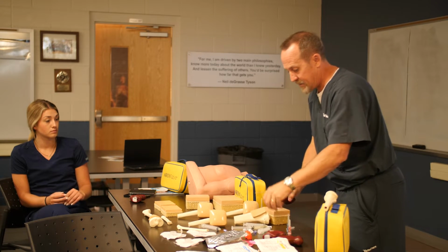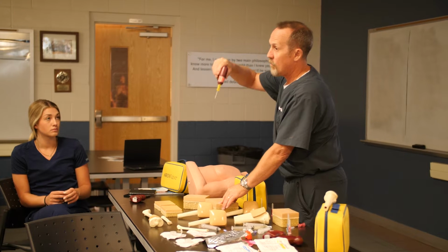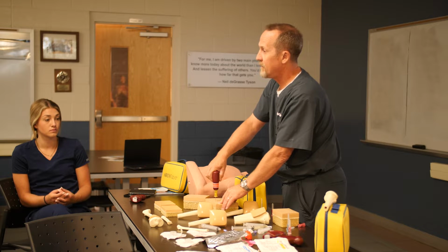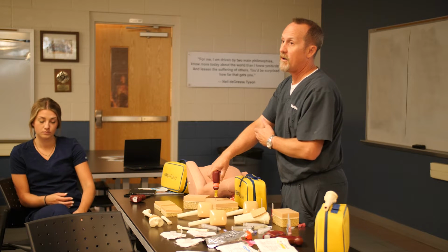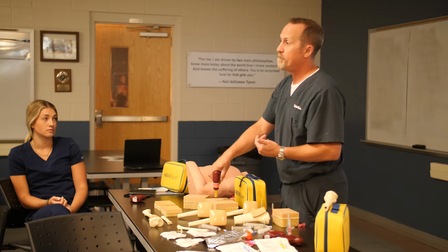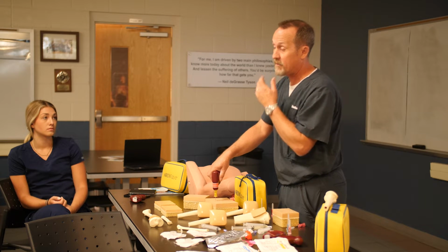We've landmarked the patient, and so now what we're going to do, let me use this one, look. Without touching the trigger, we're going to insert this into the patient, and we're going to push through the soft tissue until we hit a hard stop on bone, okay? And just to back up a little bit, putting one of these in is about the same pain on an alert and conscious patient as putting a peripheral IV in. It is a 15 gauge needle, so it's a significant pinprick, but it's pretty much similar. You're going to be putting a peripheral IV in somebody anyway. It's going to be about the same pain threshold.